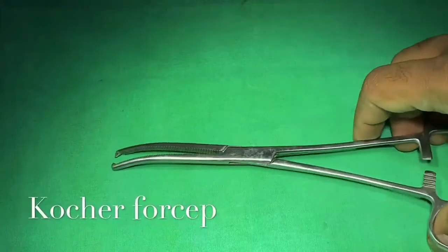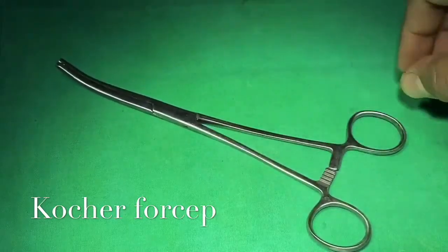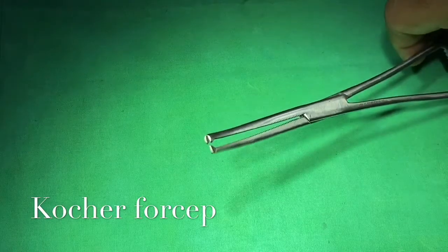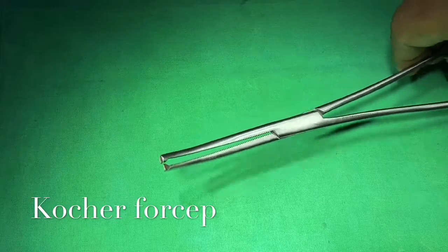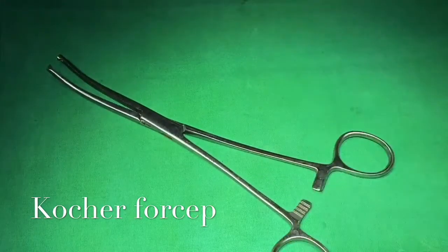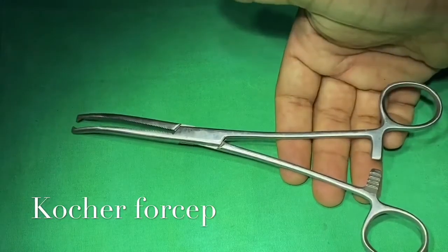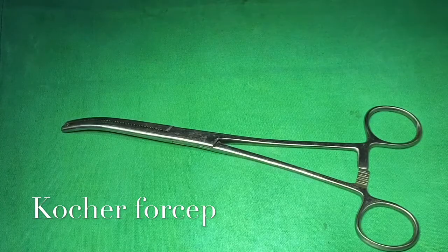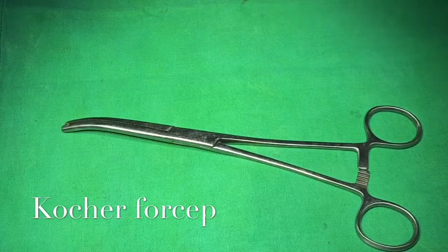This is called Kocher's forceps, which has a toothed tip with serrated blades. This instrument is commonly used for hemostasis from larger tissue and is a commonly used instrument in hysterectomy. It is named after Theodor Kocher, who received the Nobel Prize in 1909 for his work in understanding the thyroid gland.